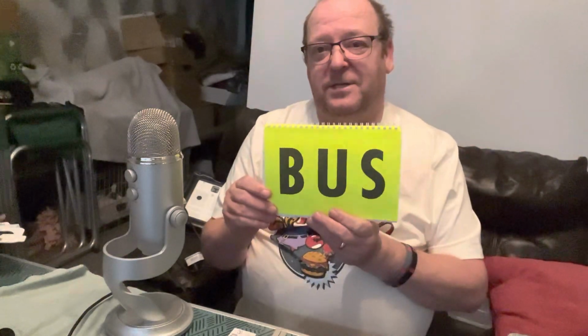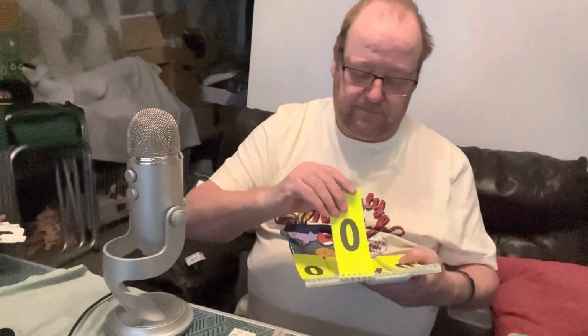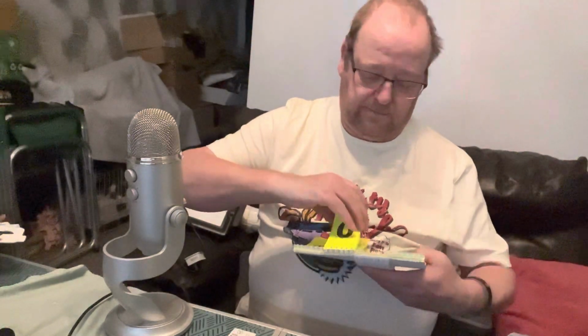Another item the visually impaired would use is called a bus hailer. On the back, it's a nice bright fluorescent yellow with "bus" on it, so you can hold that up to tell them that you want the bus. If you know what number bus you want, let's just say, for example, you want the X11, you would turn it across, there's the X, and you would hold that up for the bus.